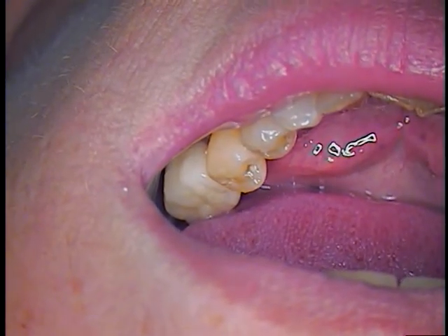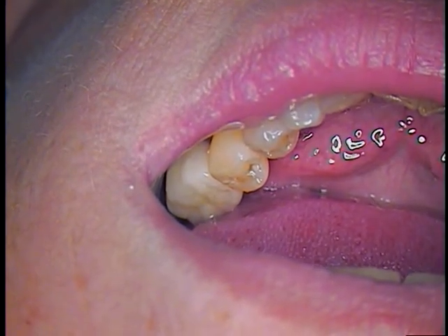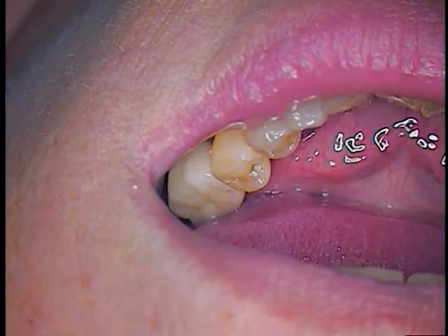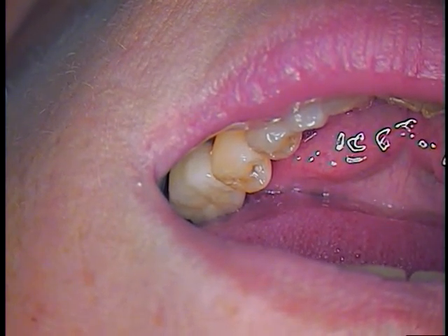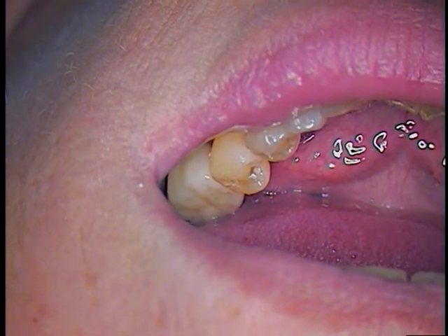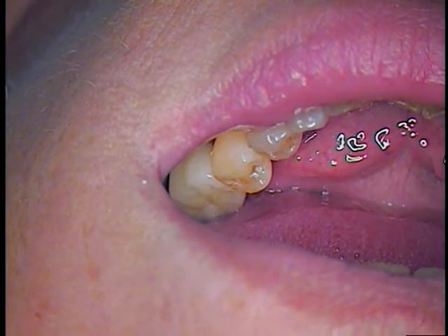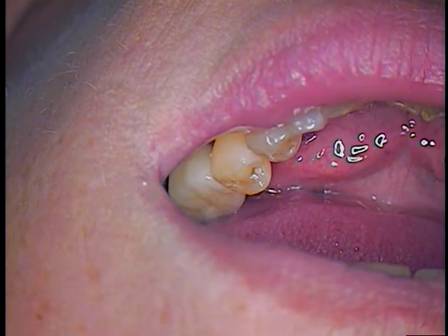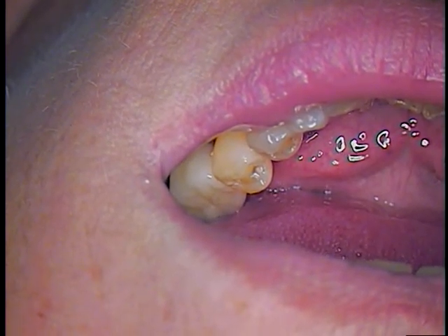The company is Thoman Medical, and the torque values are going to be 25 newton centimeters for this type of — I believe it's a vario abutment or a vario type of implant. Swiss precision, of course, manufactured by Thoman Medical.